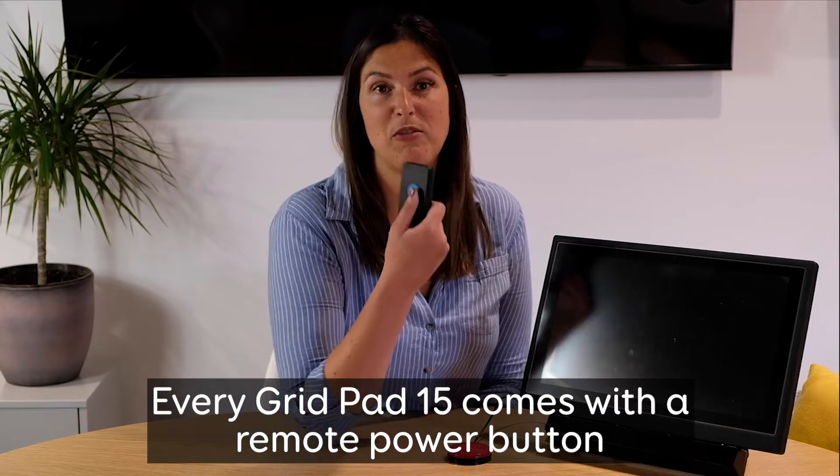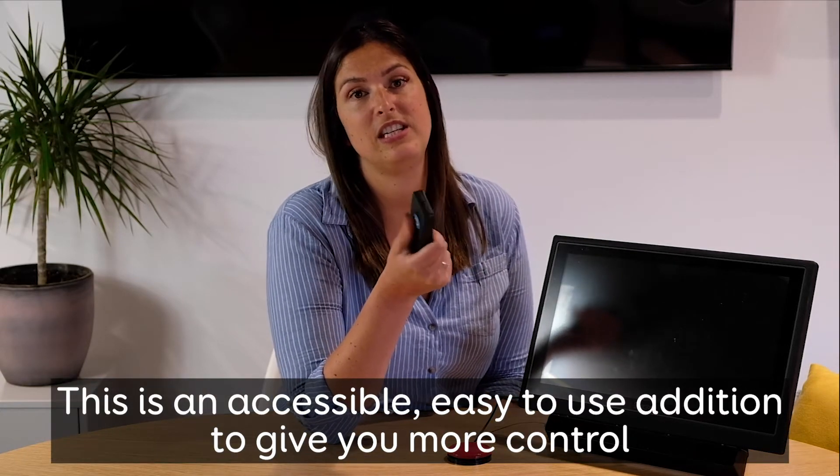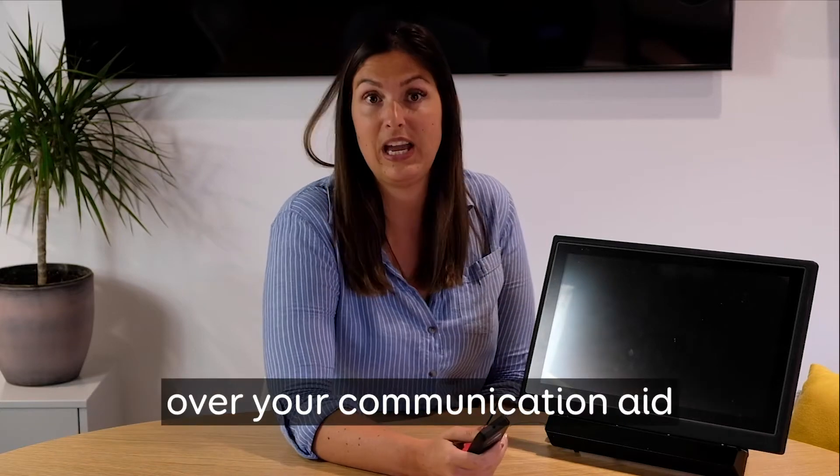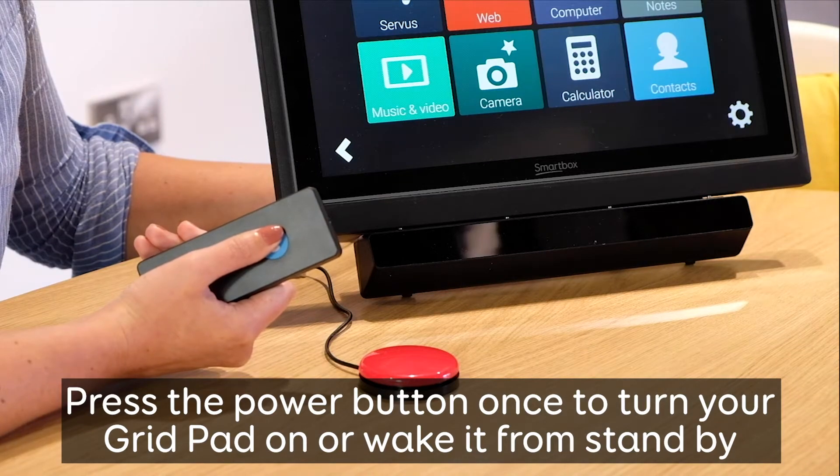Every GridPad 15 comes with a remote power button. This is an accessible, easy to use addition to give you more control over your communication aid. Press the power button once to turn your GridPad on or wake it from standby.